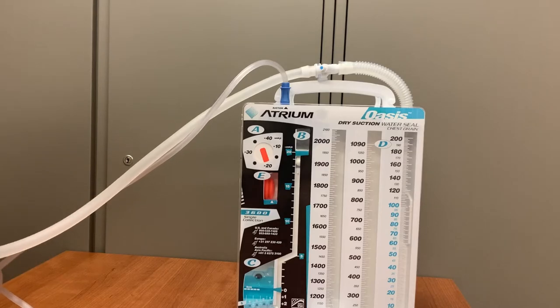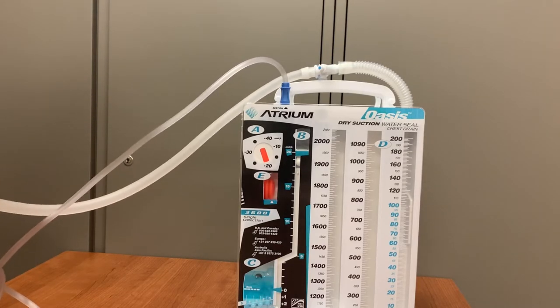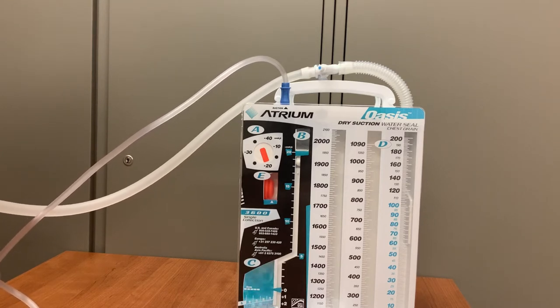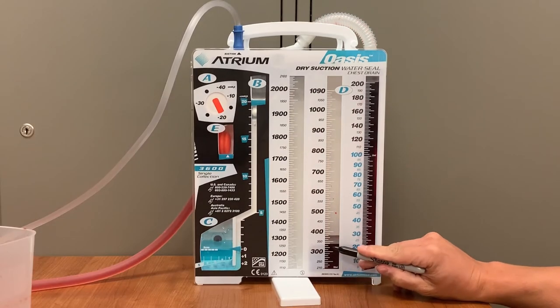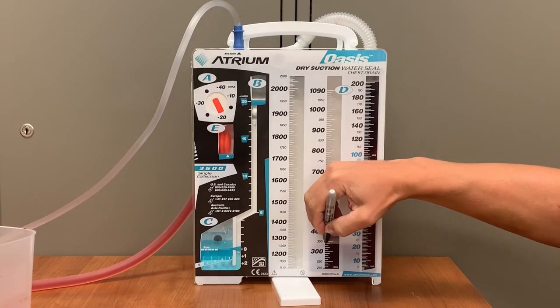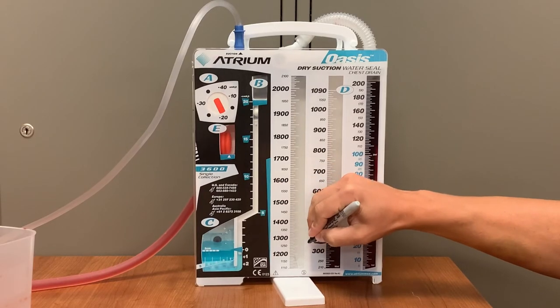Once the Oasis is set up, there really isn't much that has to be done with this system apart from monitoring it and assessing your patient. One thing that does need to be done is documenting output volume at the end of every shift. Take a Sharpie marker and mark on the Oasis container how much drainage is present at the end of the shift. Draw a line and write the date and time. Then go to EPIC and chart the output volume in the chest tube section. In this case, we will chart 340 milliliters of output.